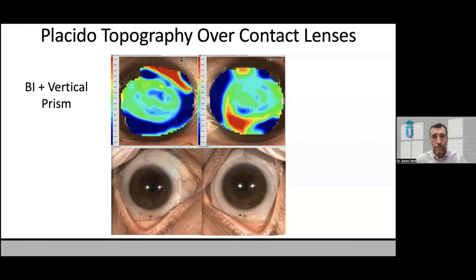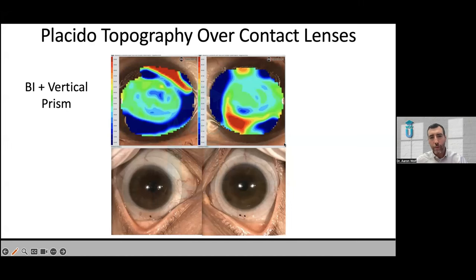Similarly, if it's mapping out optics of the contact lens, this case shows base-in and vertical prism — you can visualize that on the map. This is nice because when you order specialized lenses with these types of optics, whether multifocals or prism, you really want to be able to confirm that it's doing what it should, or that it's in the right place.